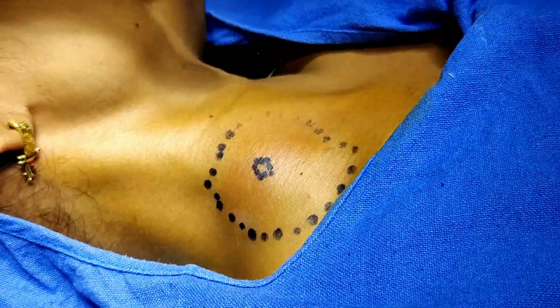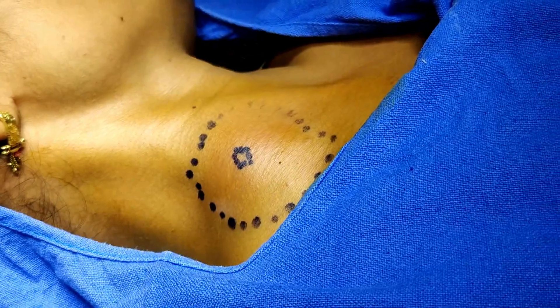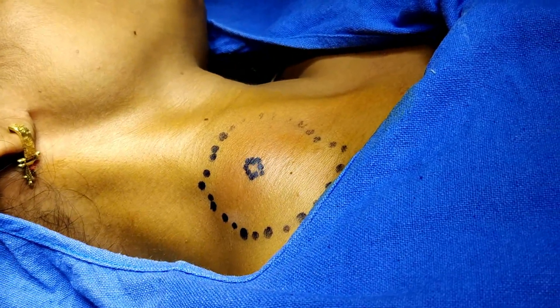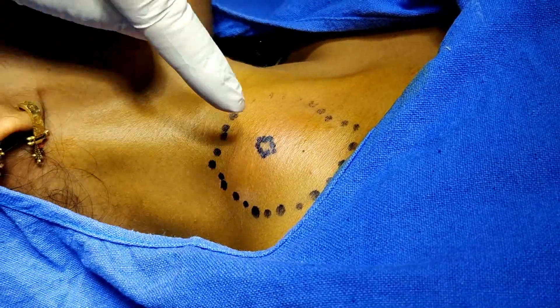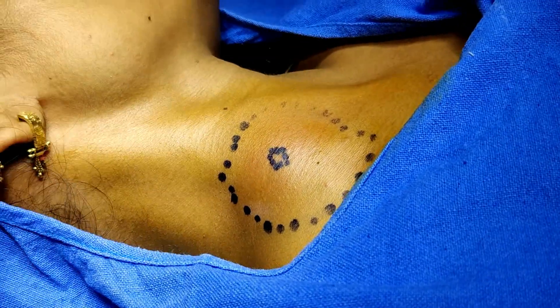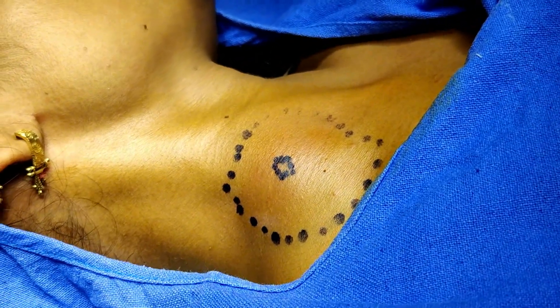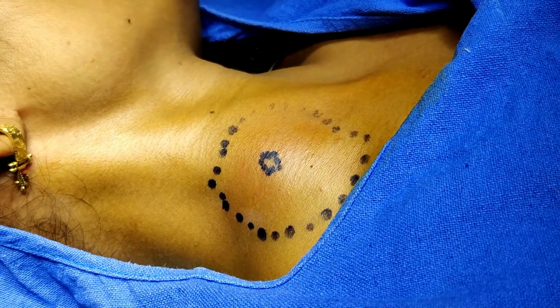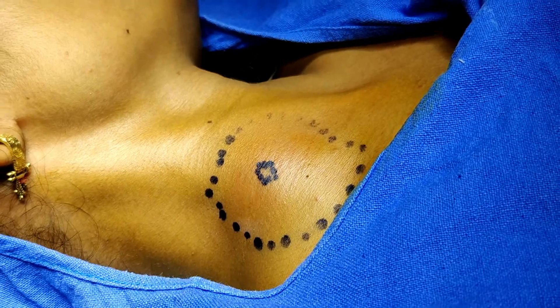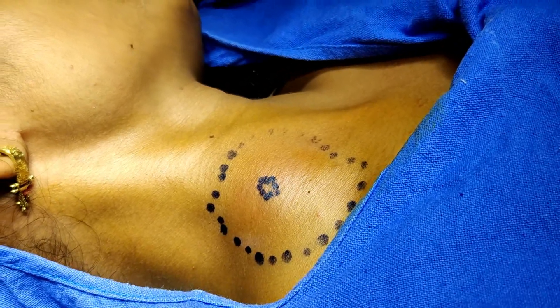I have outlined the margin of this lump here in the neck, base of the neck. The history is of four weeks; for the last 15 days she has been complaining of pain in this area. About two weeks back this was aspirated for FNAC, and at that time pus was aspirated. A second time, about 10 days back, they aspirated blood mixed with pus. The pus aspirate was negative for acid-fast bacilli or any evidence of tuberculosis.